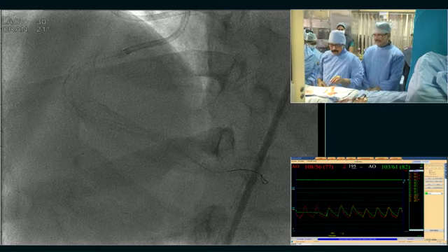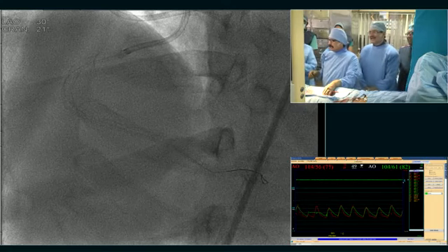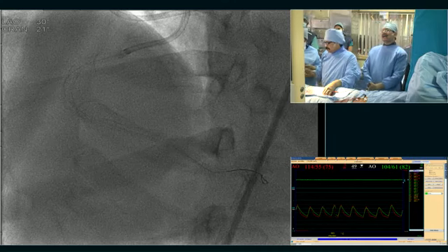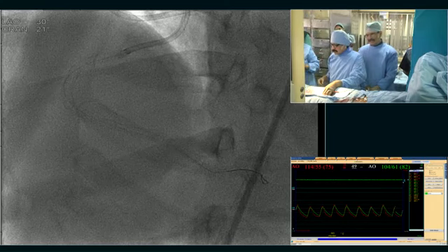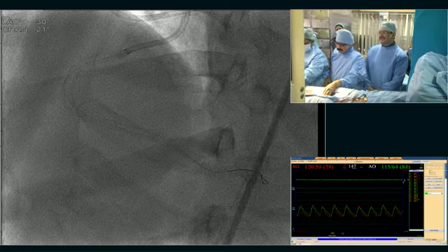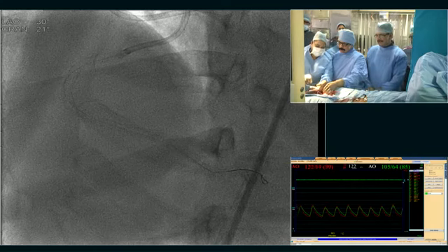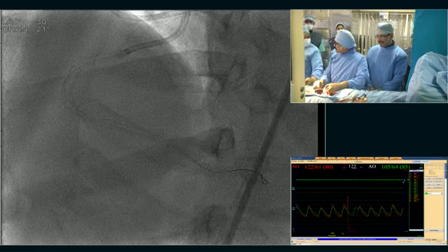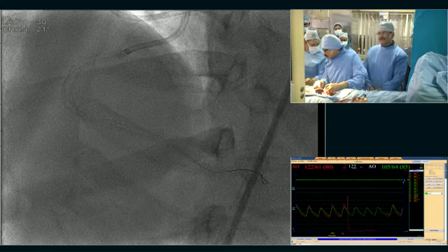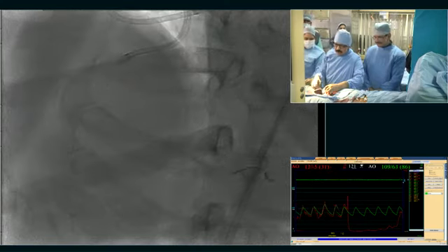I removed it. I am not interested because I know it's a three-layered stent there, and I may not achieve it. And I don't want to spoil the main stent's ISR. That is more important for me. I think it is a protected PLV, like a bypass-protected LAD. So better you have a good stent dilatation with the post-dilatation balloon 3.5, having a good TIMI 3 flow to PDA. Okay.